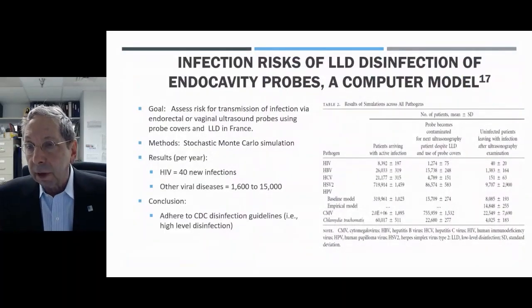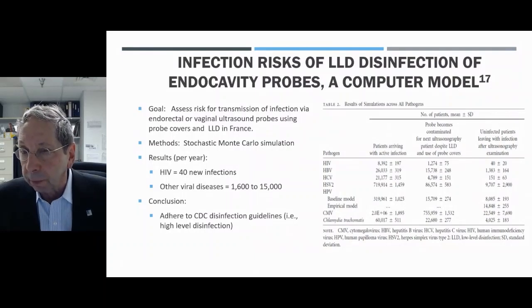Now, this is a study, Infection Risks of Low-Level Disinfection of Endocavity Probes, a computer model. I was a co-author of this study. The goal was to assess the risk of transmission of infection via endorectal or vaginal ultrasound probes using probe covers and low-level disinfection. The model was based on all cases in France. We used stochastic Monte Carlo simulation.